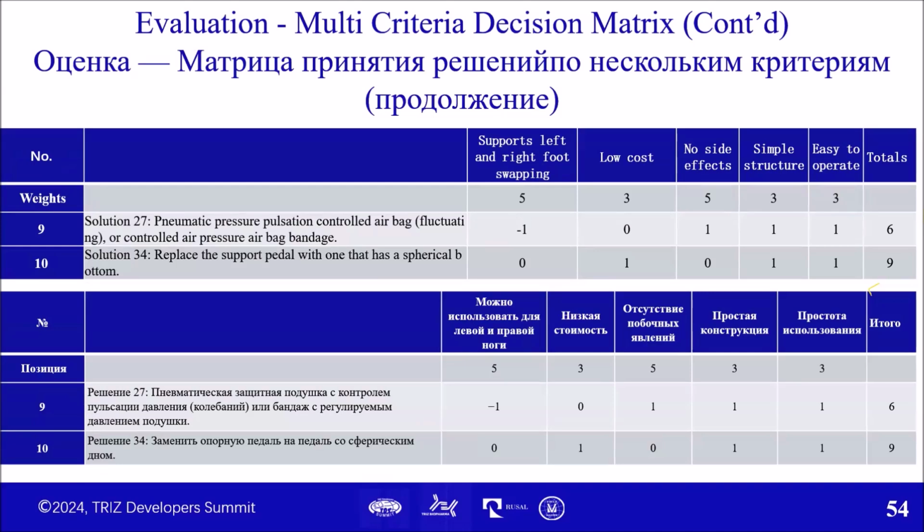By scoring them in this way, the 10 solutions are again differentiated, and the one that best meets our original design intent is chosen.